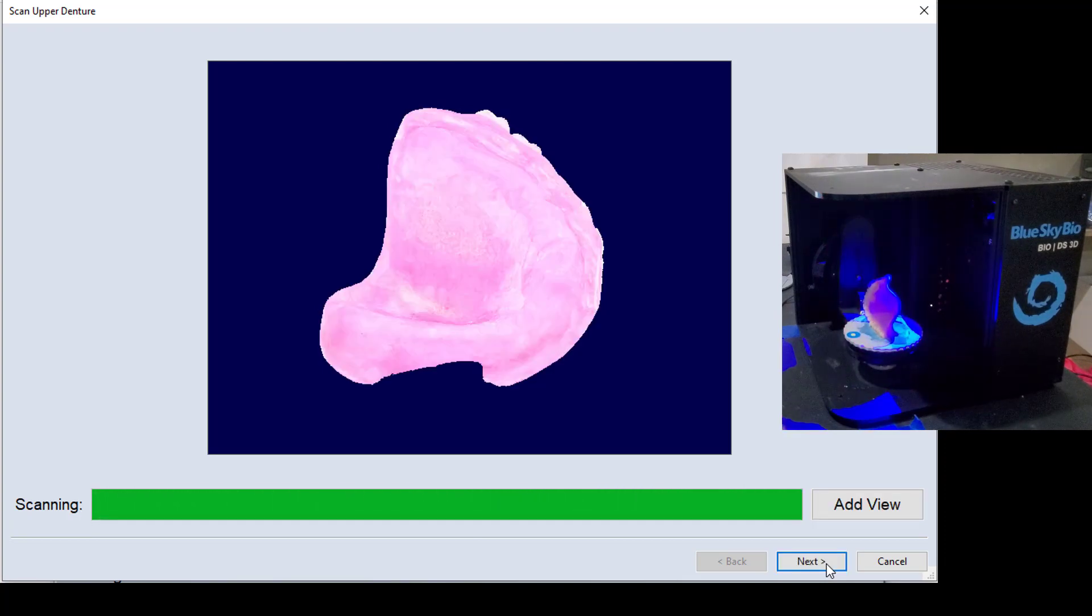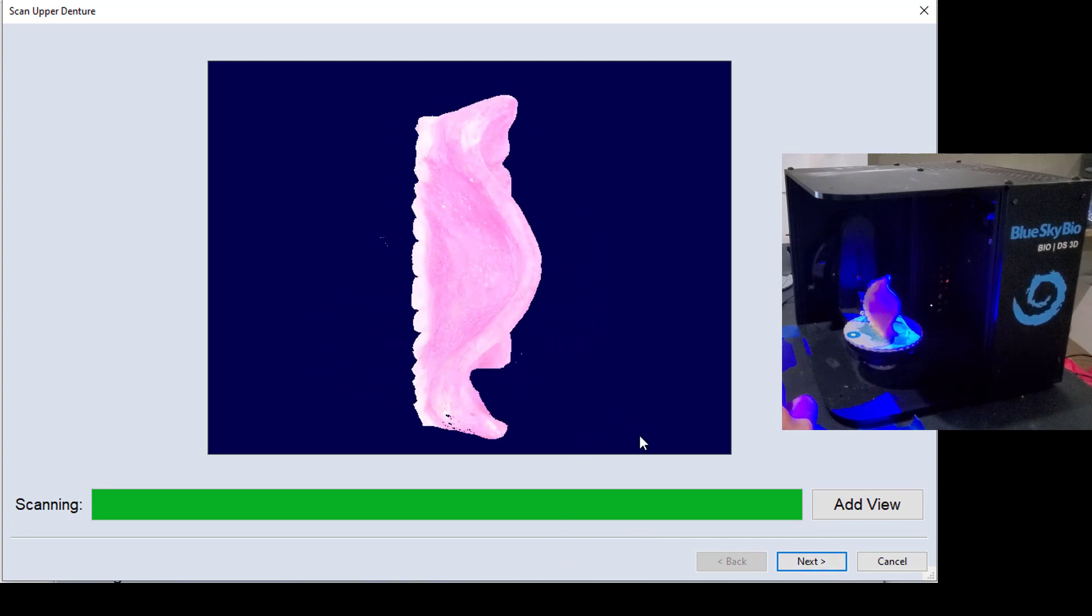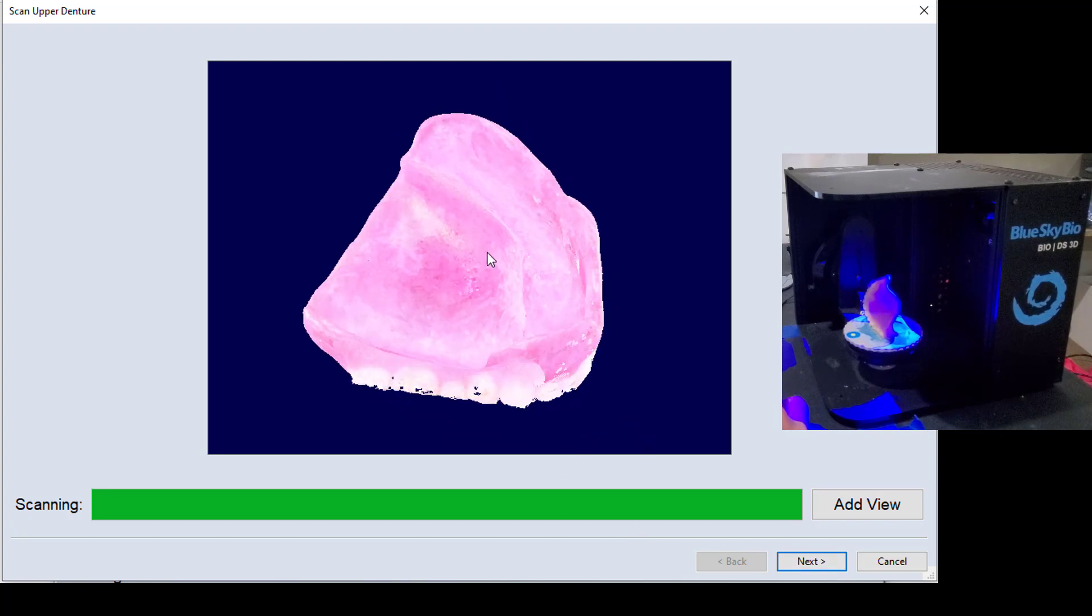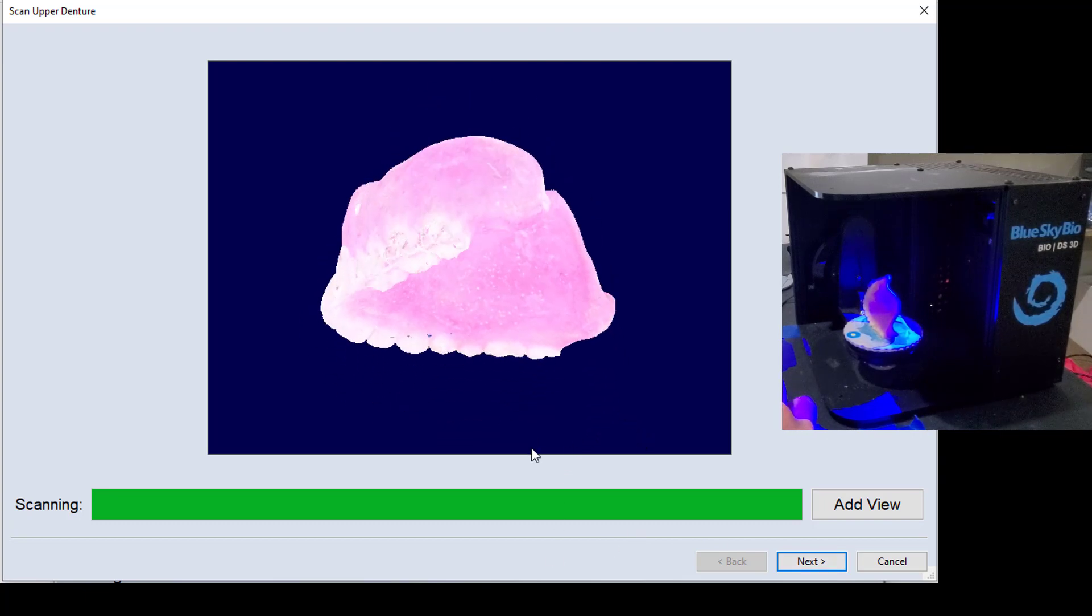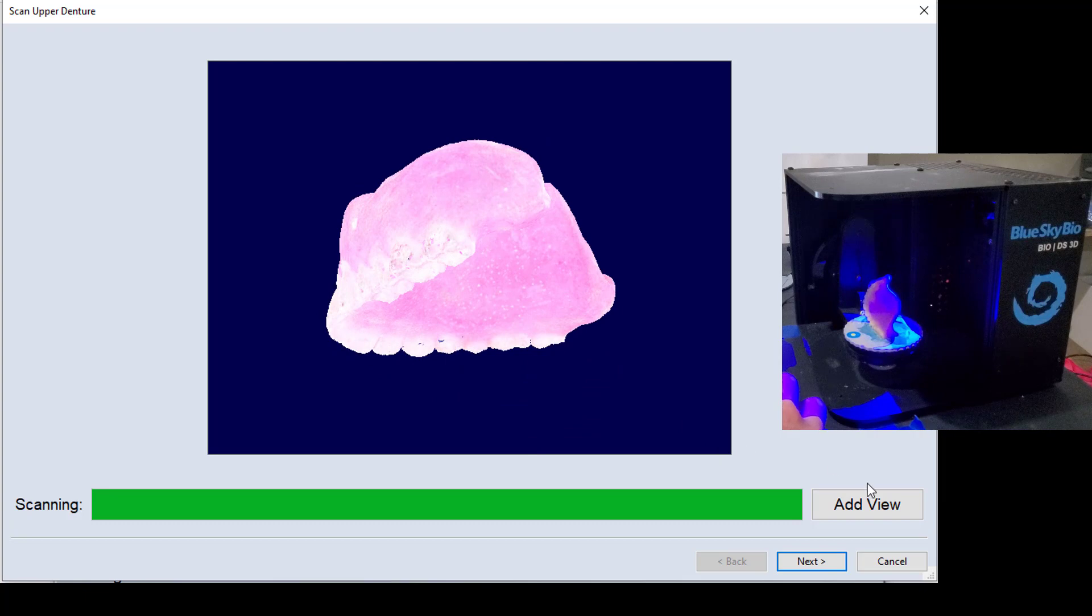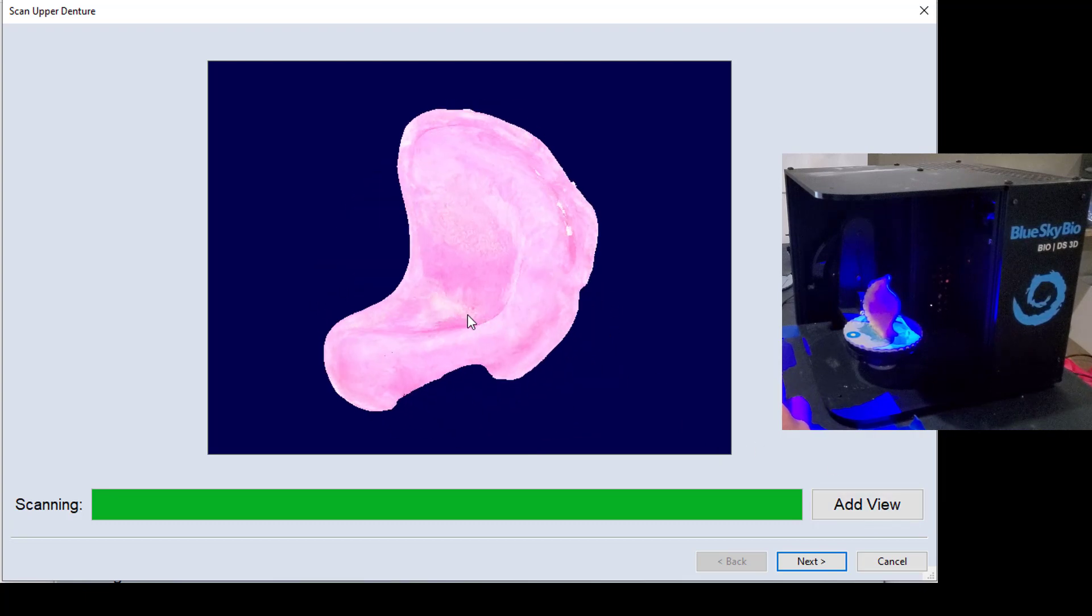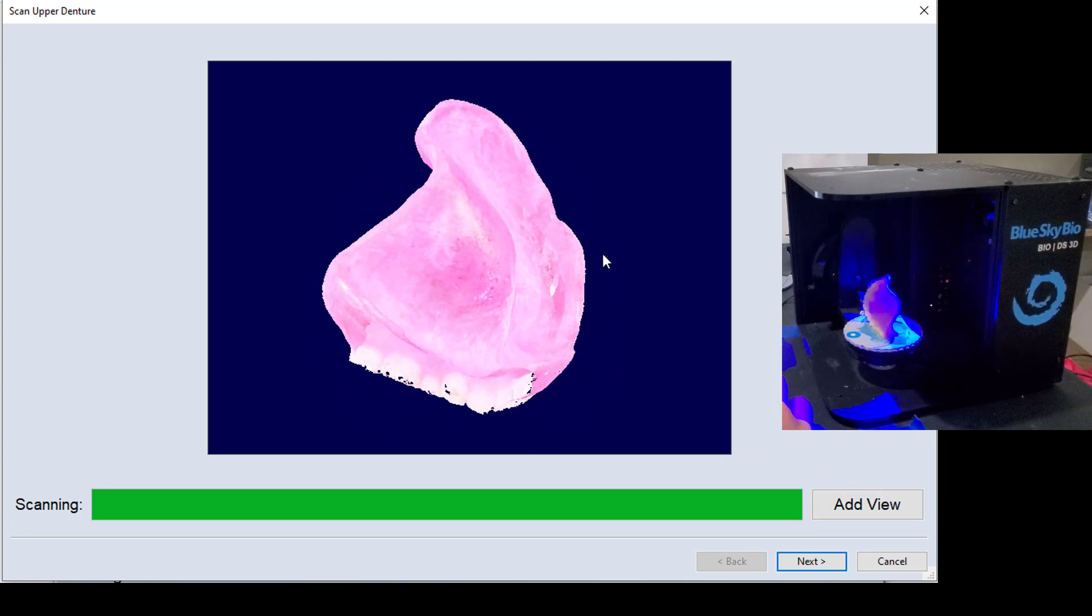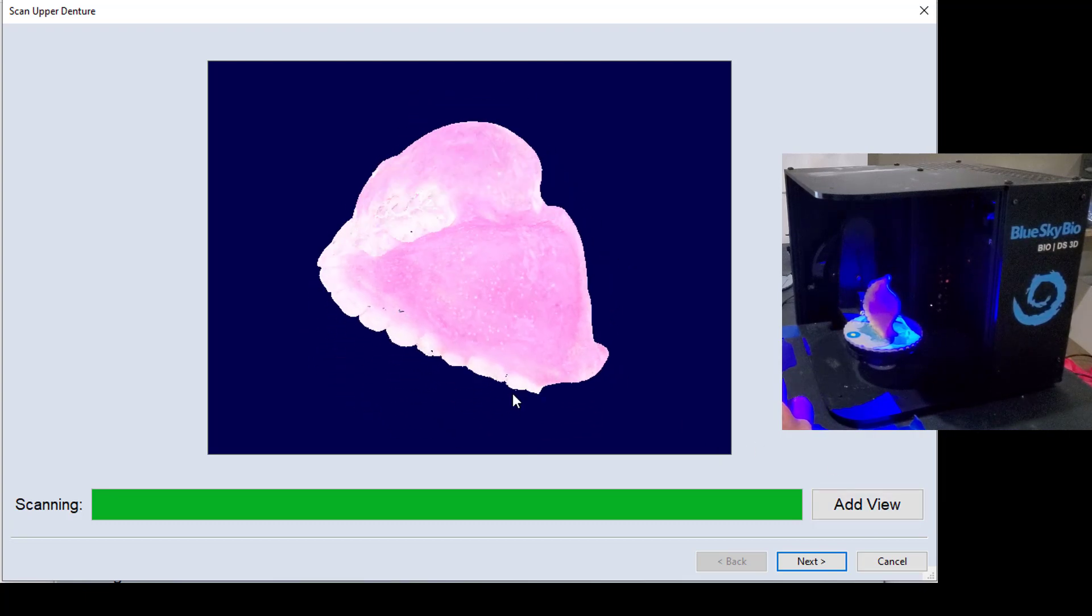Okay, with the second half of that scan finished, you can see that now we have this opposing side of the model. I should point out, you do always have the opportunity to go ahead and hit add view. If there was a very obvious hole, then you could hit add view by orienting that model towards the camera.